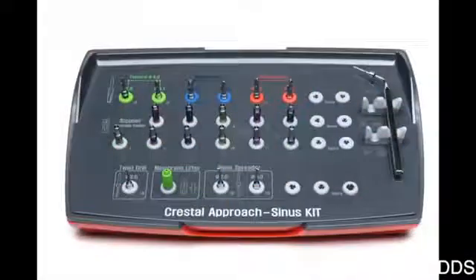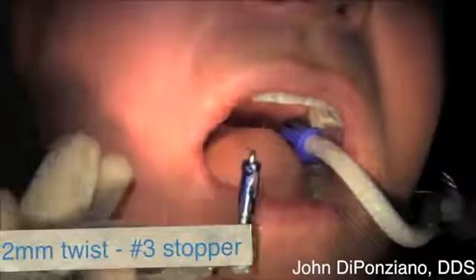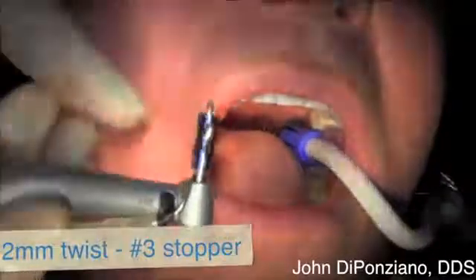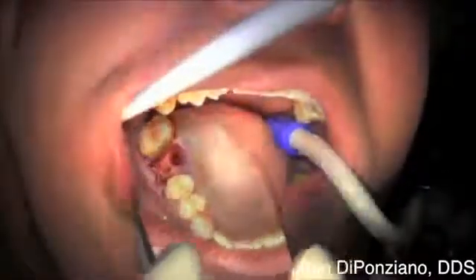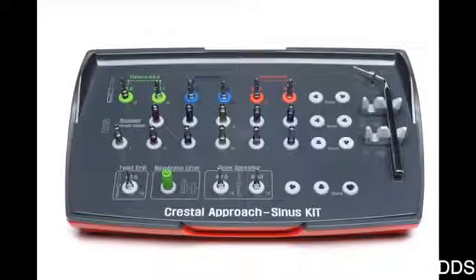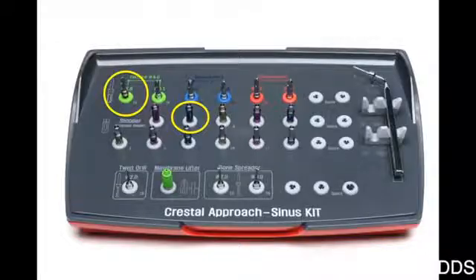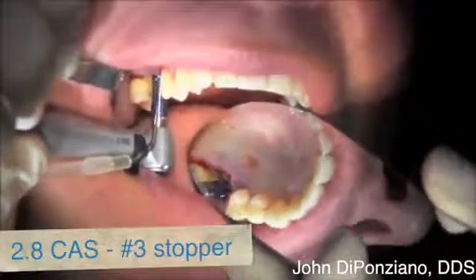Now we're going to start with the CAS kit, which is the crestal approach sinus kit by Austin. We're going to use a number two twist drill with a number three stopper, which allows only three millimeters of the drill to stick up — it's a depth limiting stopper. We then go to the actual CAS drill, which is 2.8, using that same three millimeter stopper. It has a special round tip — not a cutting tip like a twist drill would be.